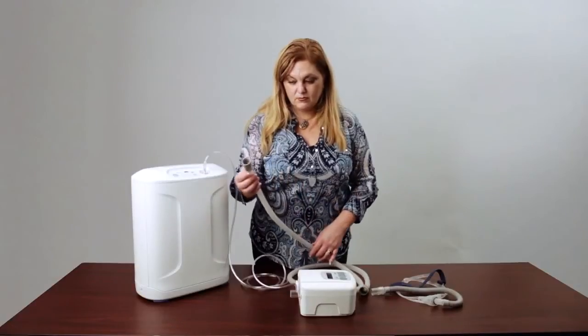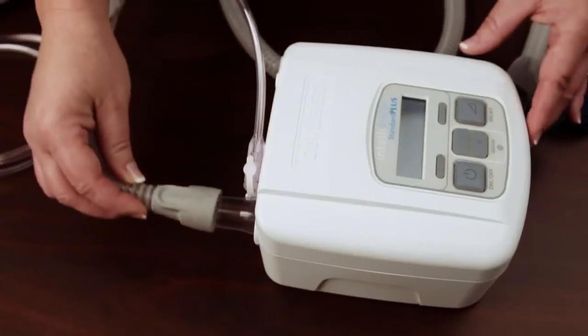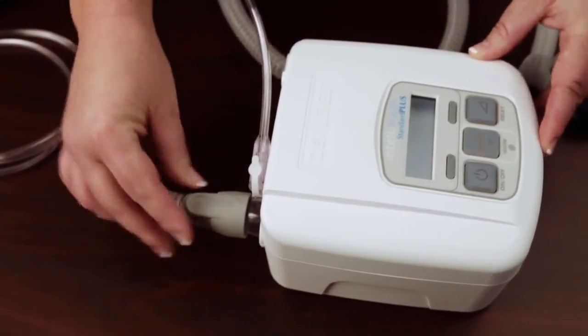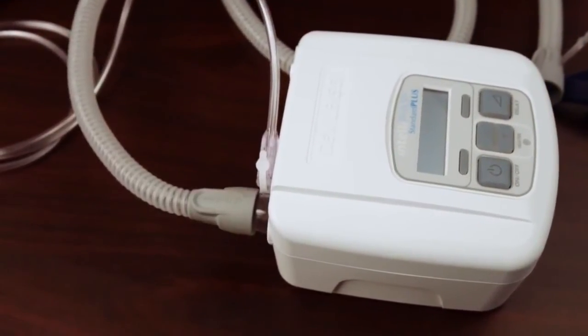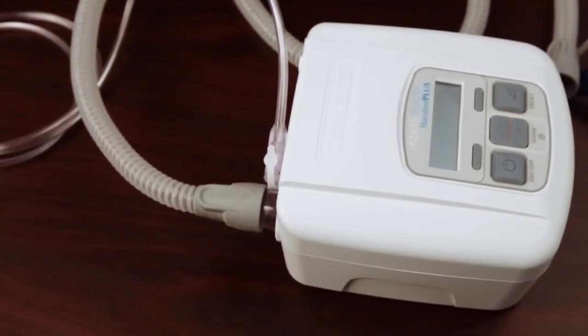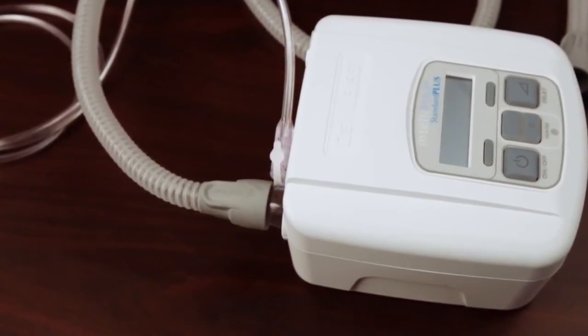Attach the CPAP tubing to the other end of the bleed-in adapter. The CPAP tubing will fit directly onto the large opening opposite the end connected to the machine.